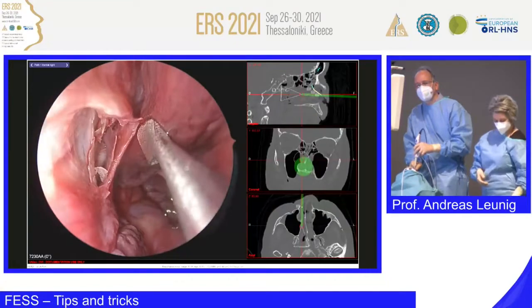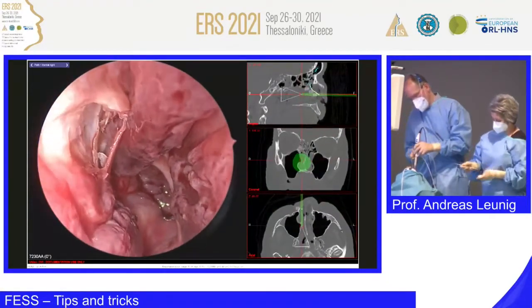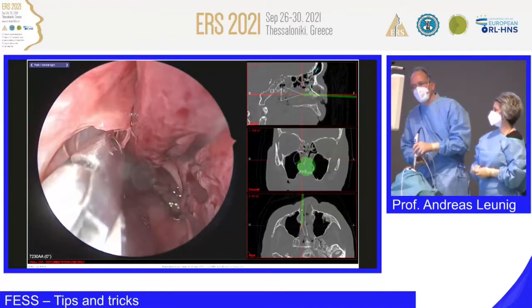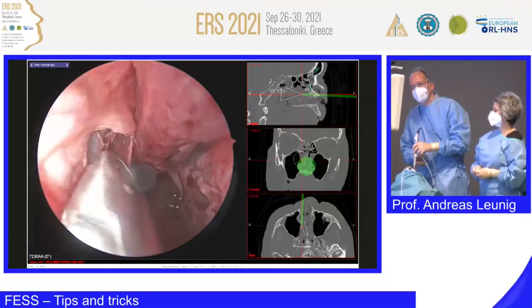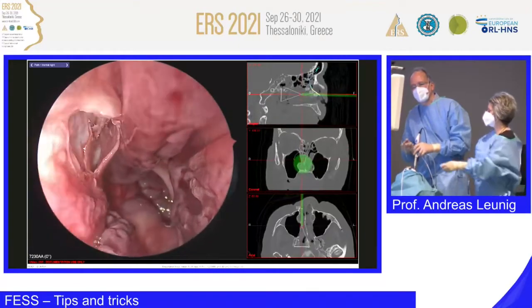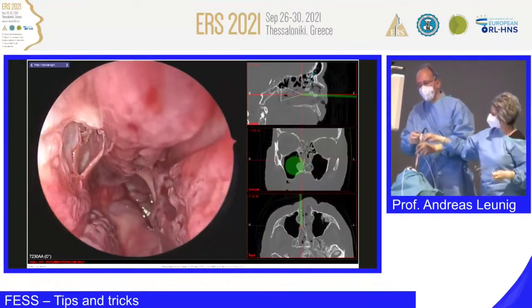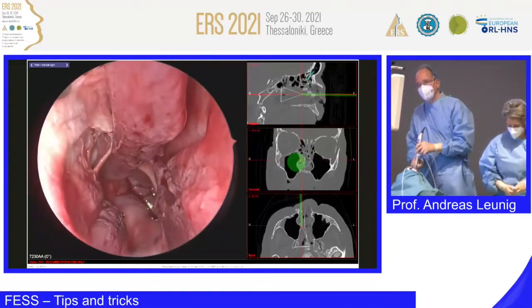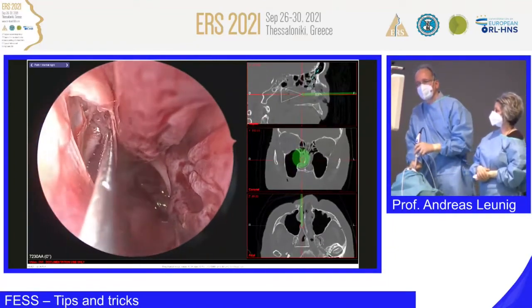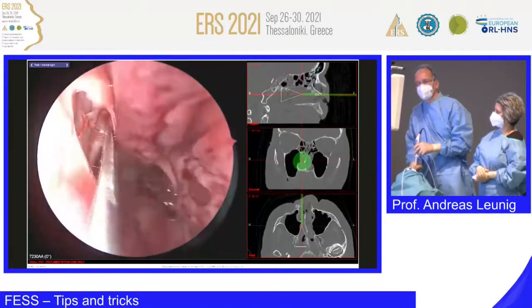Give me the Blakesley, leave it there. I take out the bony lamellas first. Would be nice to have, oops. Okay, so now it's coming. Yes, give me the Freer. So by pulling the mucoperiosteal flap medially, ideally, maybe you will find the artery. We'll see in a second, hopefully.